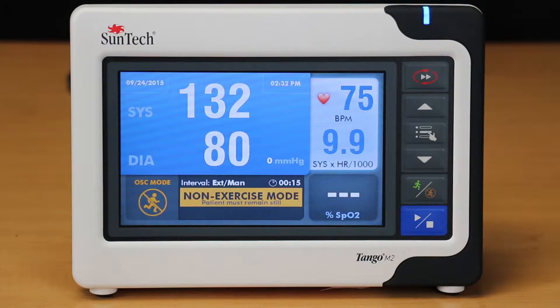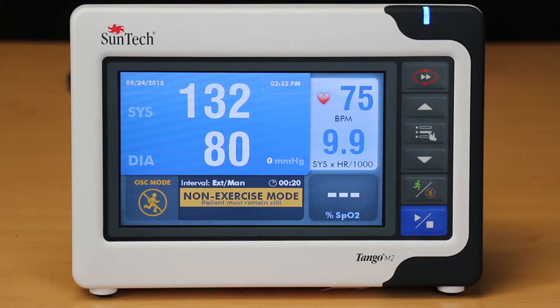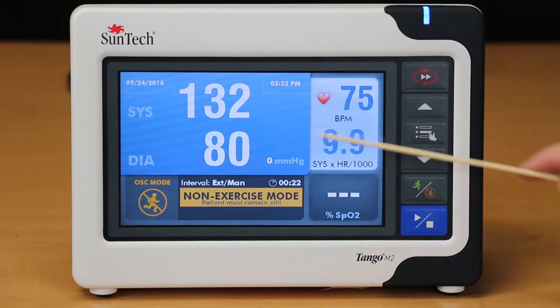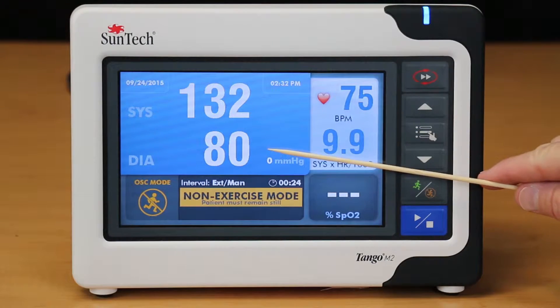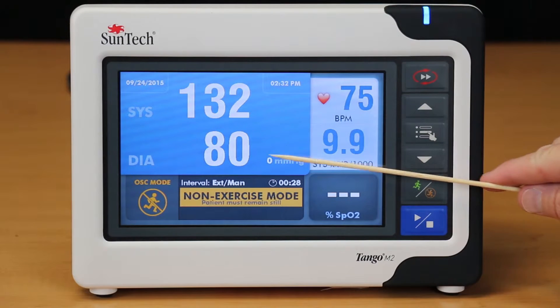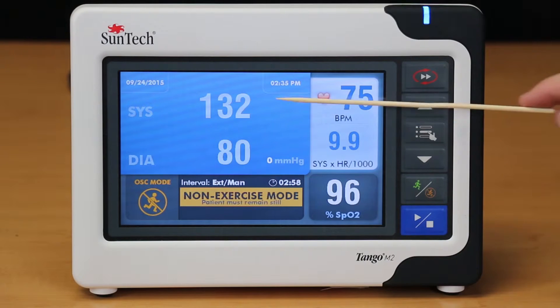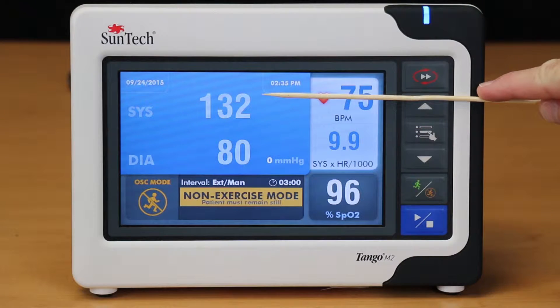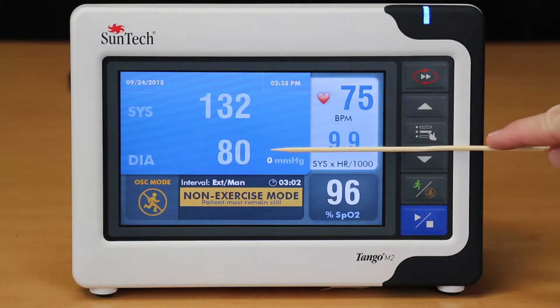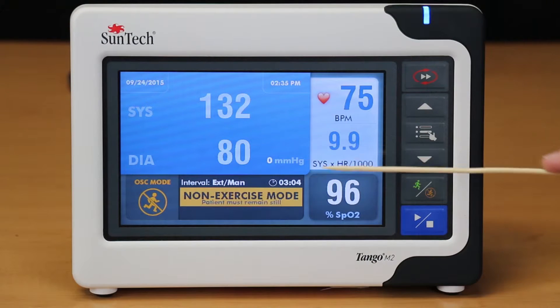One of the most important things about learning how to use your Tango M2 is to understand the data displayed on the monitor screen. Both the systolic and diastolic BP readings are displayed in large white numbers in the center of the screen. This is designed for clinicians to easily and quickly assess the most recent BP measurement. The size of these numbers will shrink and be grayed out after 60 seconds, indicating that the BP reading is now more than one minute old.